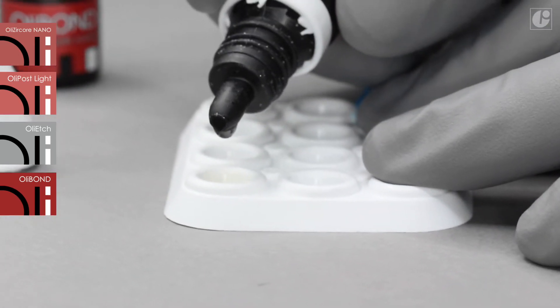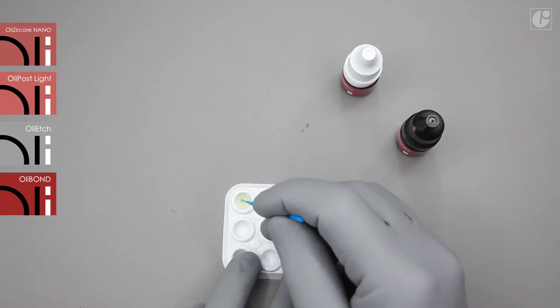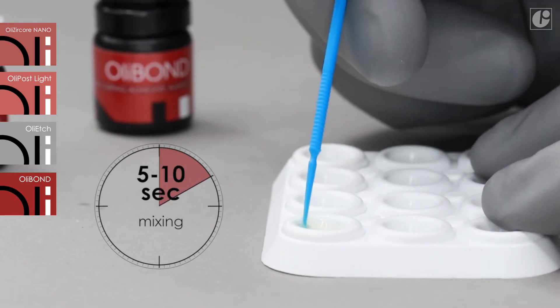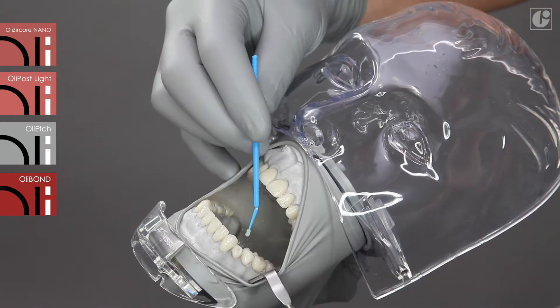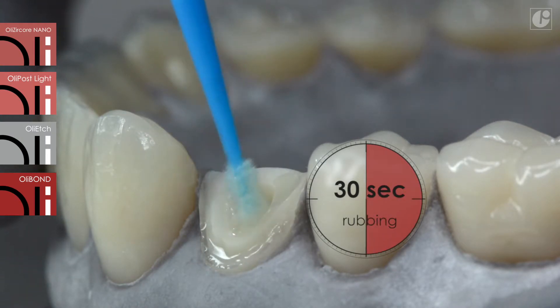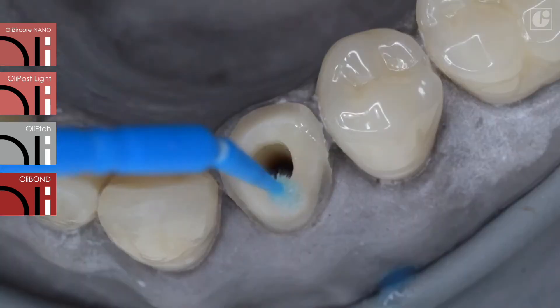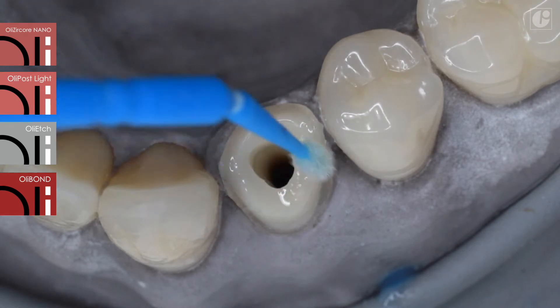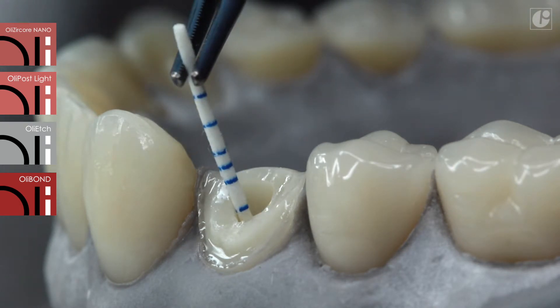In the first step, mix one drop of OliBond and one drop of OliActivator for 5 to 10 seconds with a brush. The mixture should then be applied on the prepared root canal walls and rubbed in thoroughly for 30 seconds.